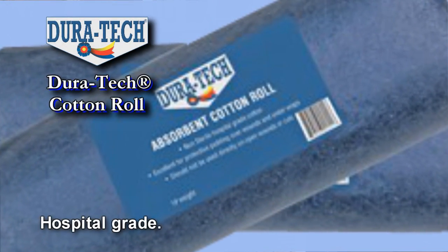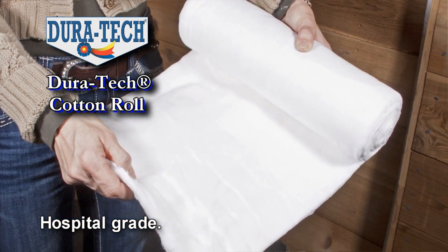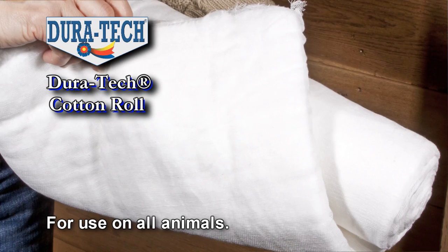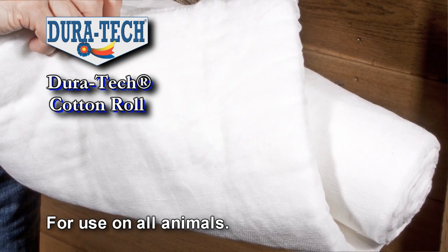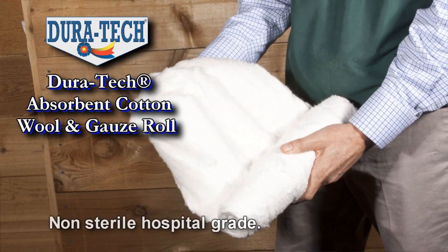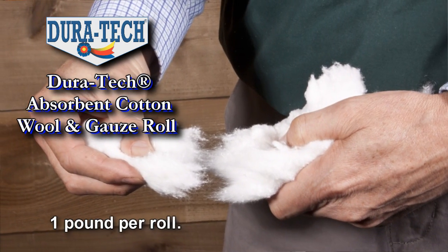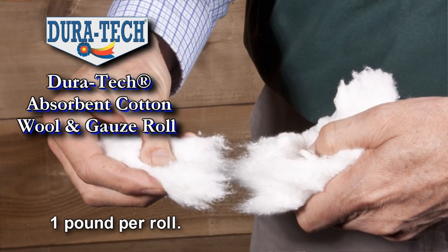There are so many uses for a roll of Duratec cotton covered with non-stick, non-woven gauze. Wound care, extra padding, and warmth are just a few reasons you should never be without it. Duratec's traditional roll of cotton is a staple in any first aid kit, so important during foaling season and any other day of the year.